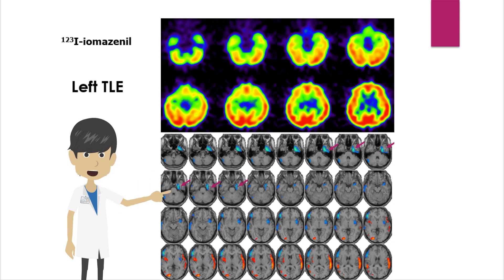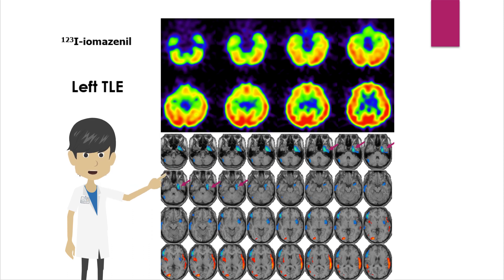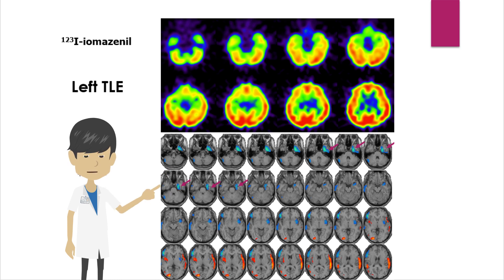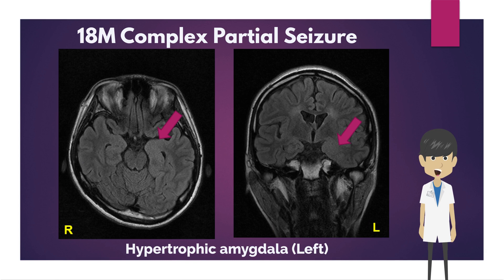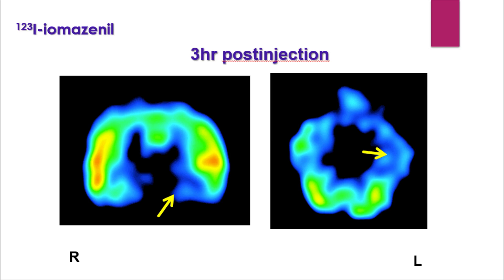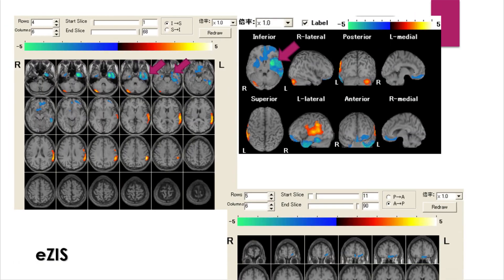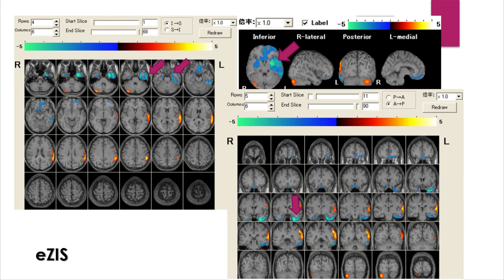This is an image of iodine-123 iomazenil SPECT in a case of left temporal lobe epilepsy, taken three hours after administration. Central-type benzodiazepine receptors are located in the cerebral cortex and the molecular layer of the cerebellar cortex. Statistical comparison with the normal database shows a decrease in receptors in the left medial temporal area. In a case of complex partial seizure with enlargement of the left amygdala, iodine-123 iomazenil SPECT shows a decrease in accumulation in the left medial temporal area, and statistical comparison reveals decreased receptors from the left medial and basal temporal areas.